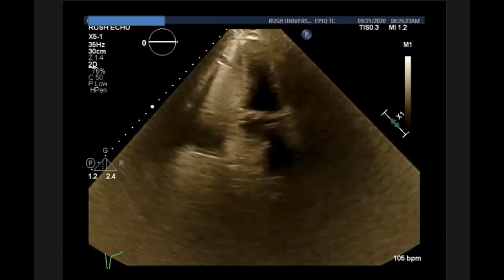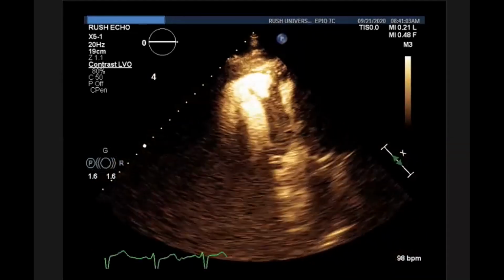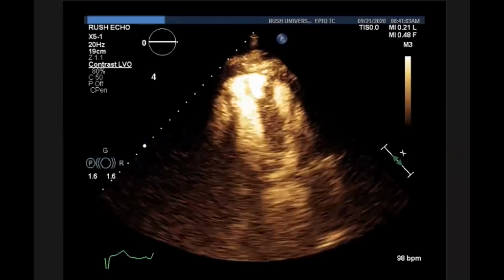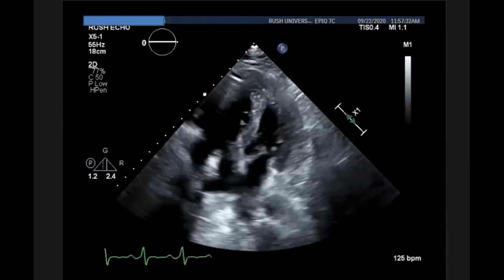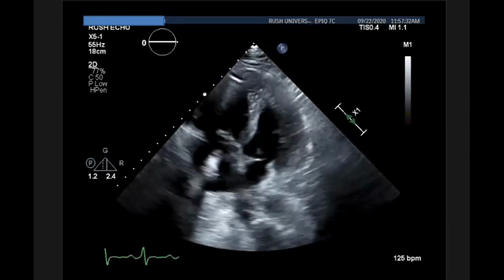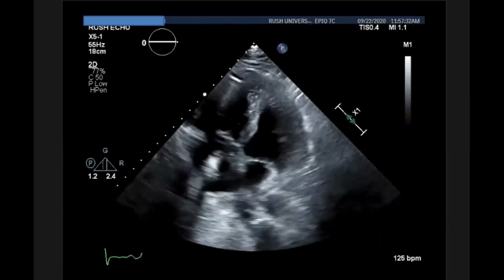So we were concerned if there was thrombus within the patient's RA and RV. We ended up giving the patient contrast, and we could see that the RV was huge, but the contrast was getting through readily to the LV. So we did not think this was thrombus. And what we found out is that when the patient went to the OR, he had breaks in the cannulas. And so that was all air within the system. And once his cannulas were replaced, unfortunately, this patient died, but the air was gone and the ECMO alarms no longer were ringing.